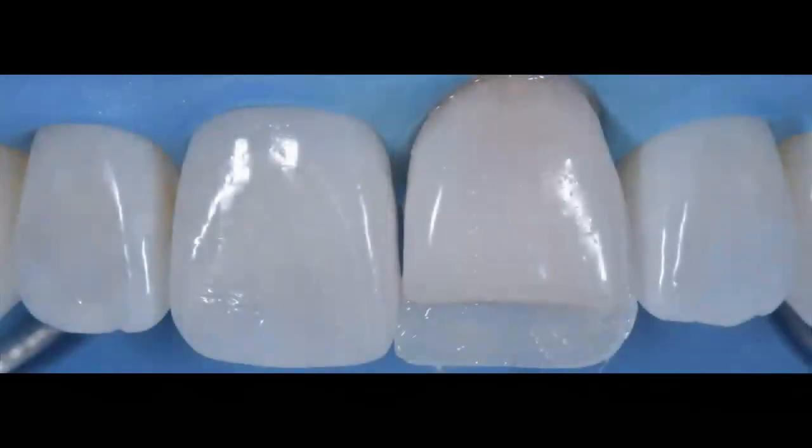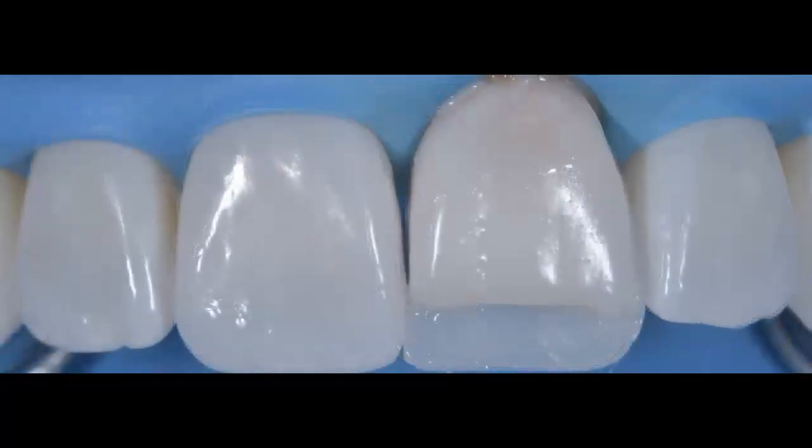Once I have that, you can see that I've created the ideal length, the correct distal embrasure, and the correct mesial embrasure also. Because I don't want to overdo this, I don't want to make this tooth longer because there are so many aesthetic layers, clears and white opaques and mamelons and everything on that incisal third, that I don't want to have the need to create a very long tooth and then cut back and end up having less than what I really need, or even more than what I need of those effects in that incisal third. So starting out with the right length is always ideal.